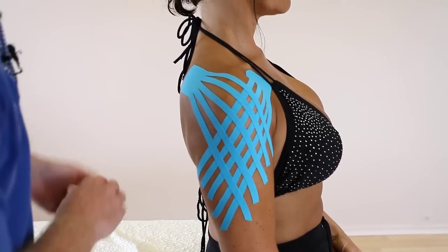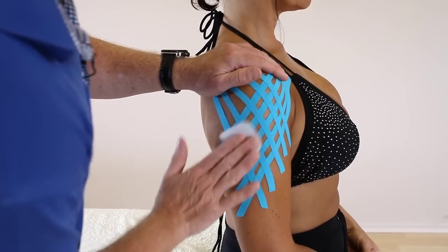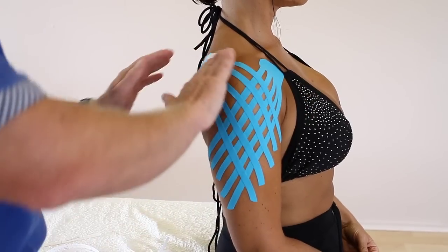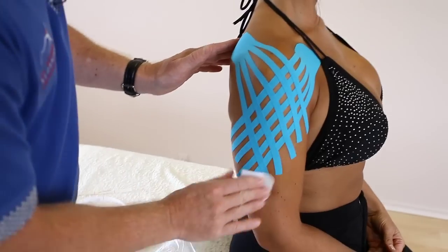Be careful when you actually warm this one up so you don't cause any of the tape to lift. And this would be kinesiology taping for oedema and bruising of the shoulder. Thank you.